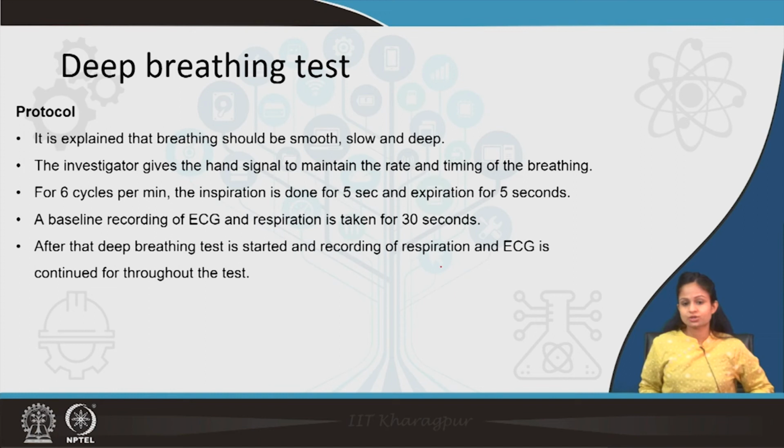Next, coming to the slow or deep breathing test. In the slow or deep breathing test, the breathing should be smooth, slow and deep. Most of us have seen this in yogic breathing or pranayama, where the breathing should be very slow and deep, not fast. The investigator should give a hand signal to maintain the rate and timing of the breathing.